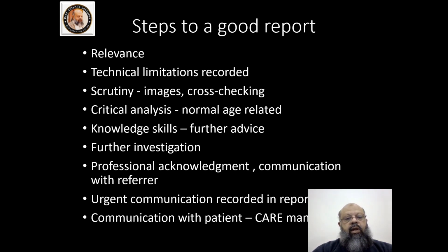Then the critical analysis: we have to assess the pathologies or abnormalities and their relevance to the age. For instance, in older age we can get a positive finding, whereas in younger age it will not be a normal finding. Then is the knowledge and skills of the sonographer or radiologist, and further advice, whatever advice we can give to the patient, and further investigations if recommended, we can mention. We can have professional acknowledgement or communication with the referrer.